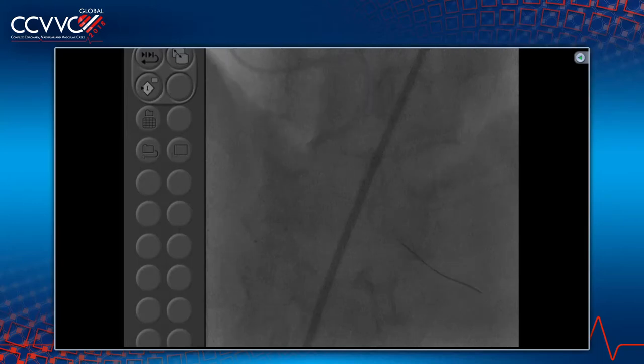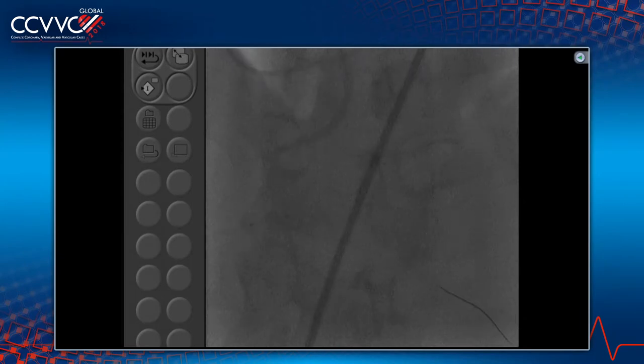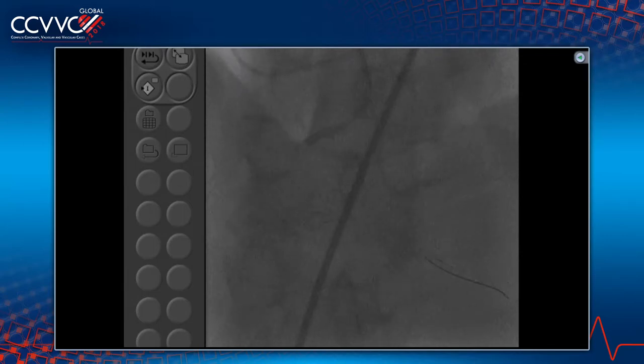I noticed she didn't use trapping. She likes these long wires, but of course, maybe trapping is the way most people would prefer nowadays. In fact, she's also very confident using these aggressive Amplatz catheters. I would personally use a normal Judkins with a GuideLiner, which gives you the confidence that you can put the guide extension inside for similar support and also use it for trapping.